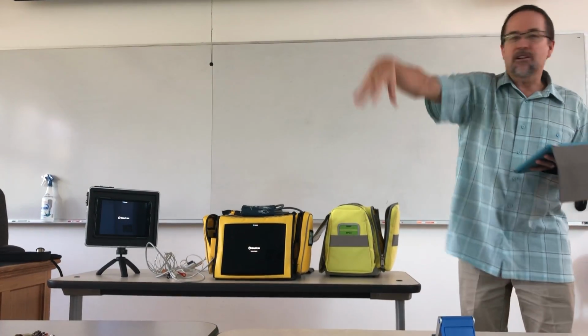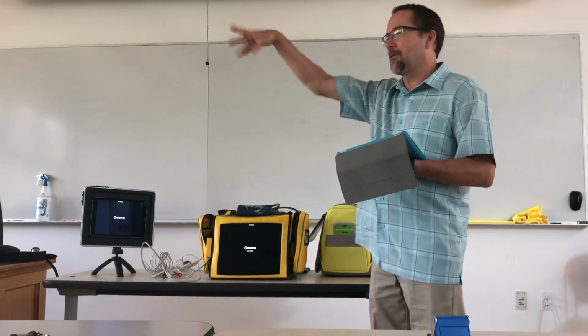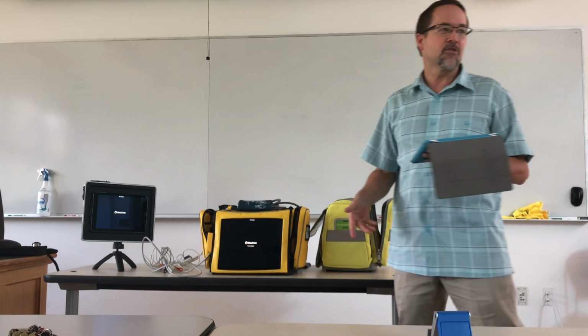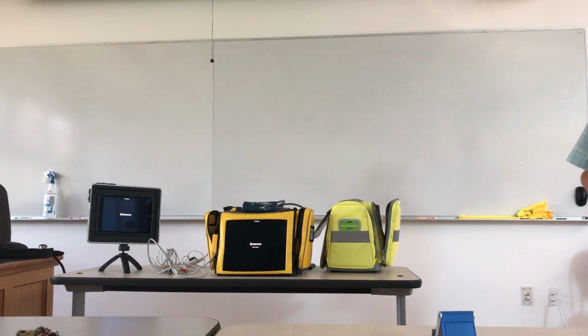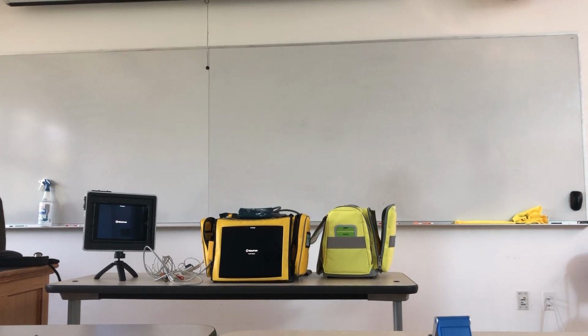If the Apple TV's in the classroom down the hallway and you're outside running the scenario, you get done, okay, everybody go in here, we're gonna debrief, pop it on the screen, and you've got the review. This is the way paramedic testing's gonna go. We're all using these now, I mean, for the state testing.